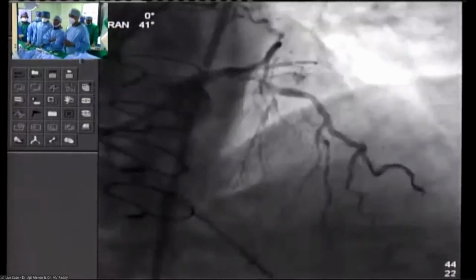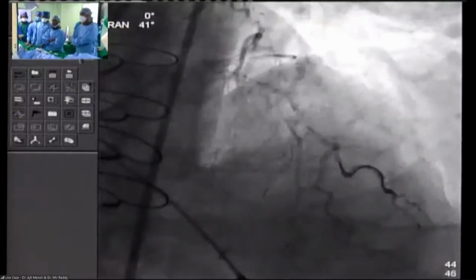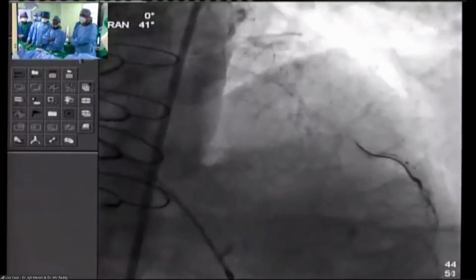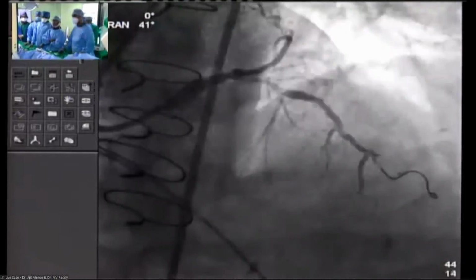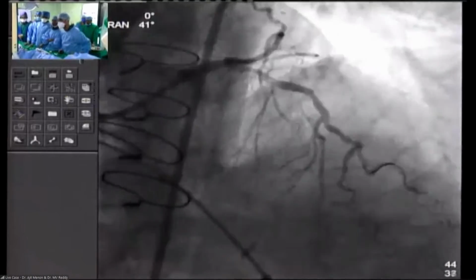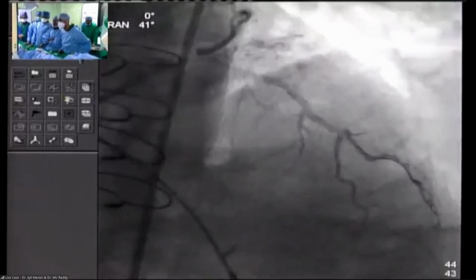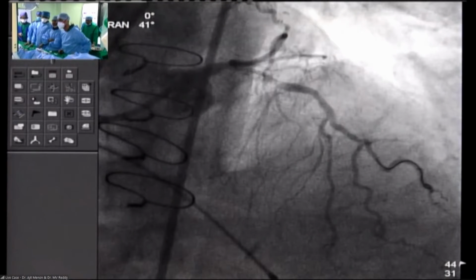The thing I don't truly understand is whether that territory is ischemic, because you have flow down the native LAD, and you have flow coming down the LIMA. There is some intervening disease into the diagonal, but it's not horrible, so it could theoretically backfill. But more importantly, for right now, after that event that occurred, this all was relatively stable, and the culprit to me seemed to be the vein graft. So before proceeding and doing a lot more here, I probably would walk away and then regroup. But obviously, you know the patient a lot better than I do.